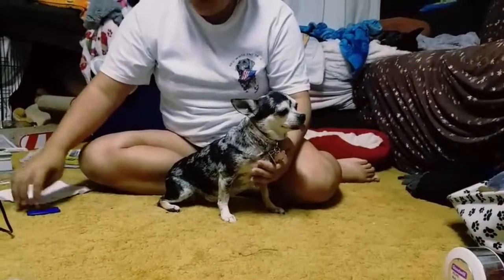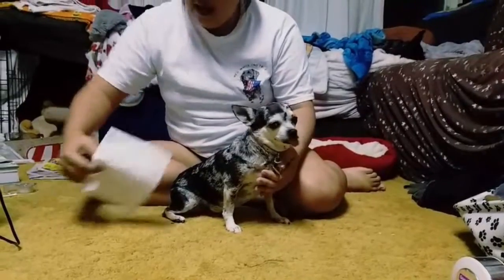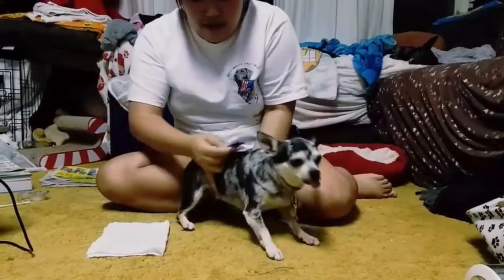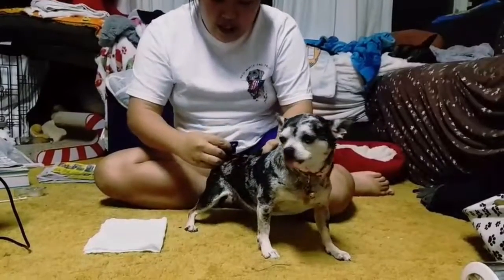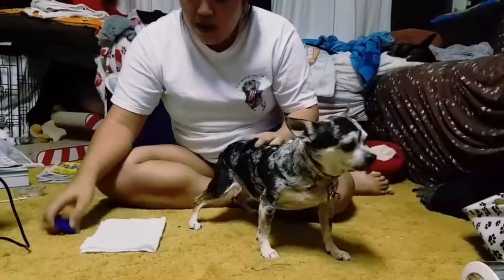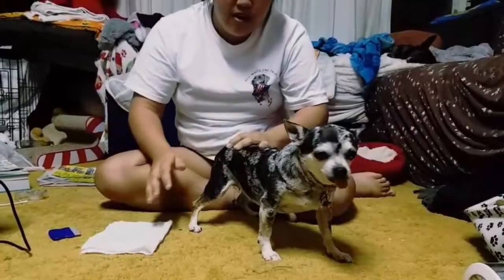So to check for fleas, you need a flea comb and a wet paper towel. You're going to comb the animal through, checking where they like to go by the butt, and then you're going to check it on a paper towel to see if there's flea dirt.